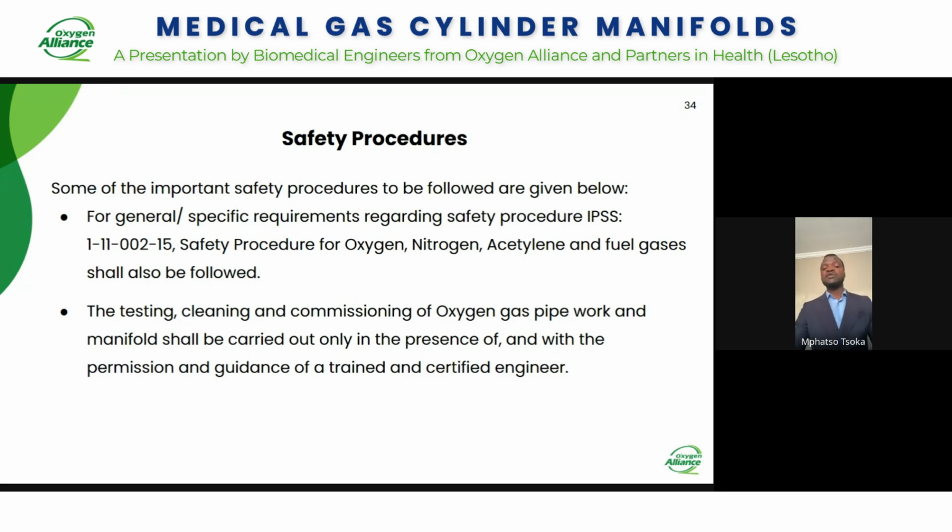be followed. And there are a number of guidelines that can be found and downloaded, whether from WHO or from manufacturers of a certain product, that can be followed to ensure that the work being done or the system being used is certified and permitted for patient use in a health setting. The testing, cleaning and commissioning of oxygen gas pipe work, whether it's a manifold, shall be carried out only in the presence of, or with the permission and guidance of, a trained and certified engineer.